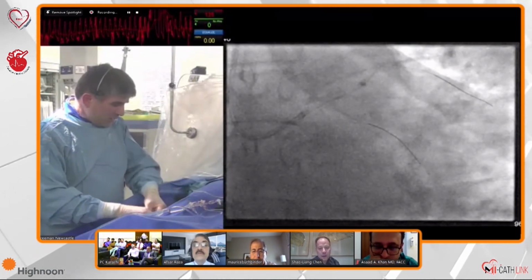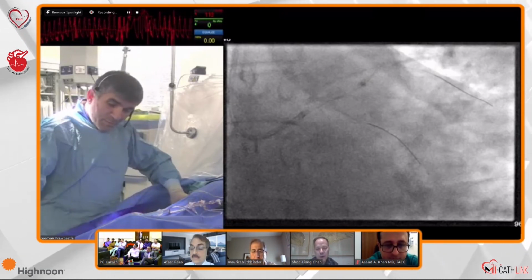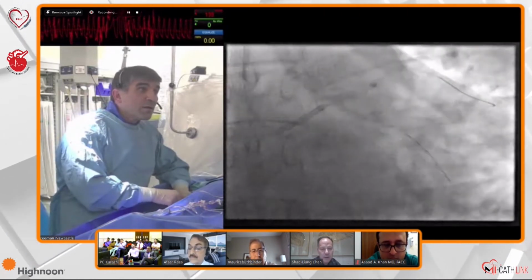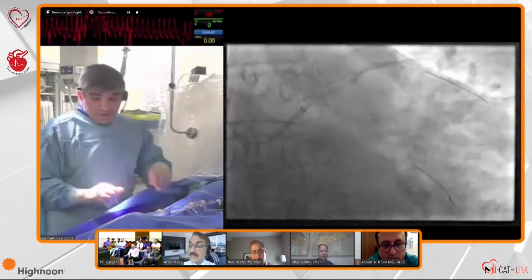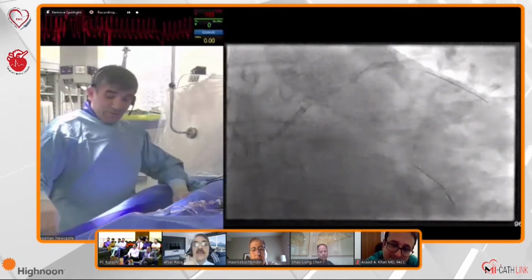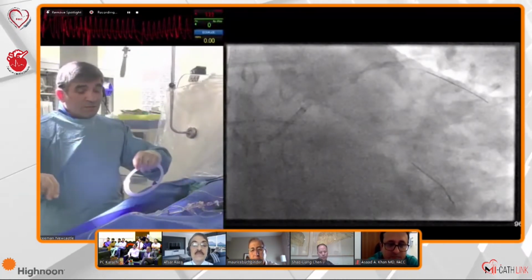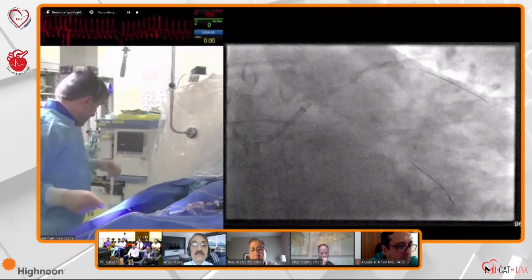Basically, in terms of the provisional stenting technique, we always try to dilate the side branch. So what's your suggestion? Okay, it's an excellent question. Again, the debate goes on. If I'm honest, and this is my approach on how I do my cases, if I decide that I'm not going to treat the side branch, I don't do anything to it.